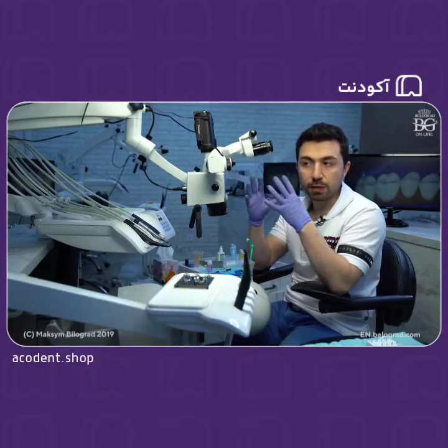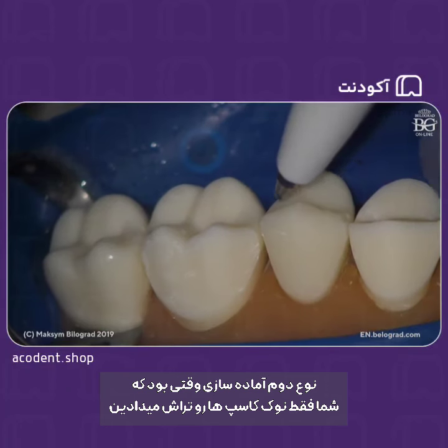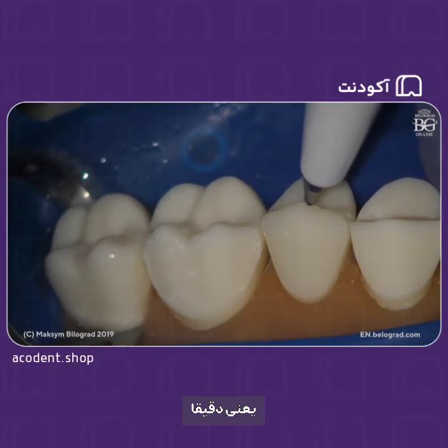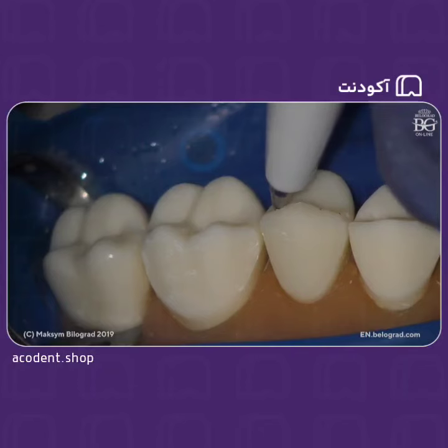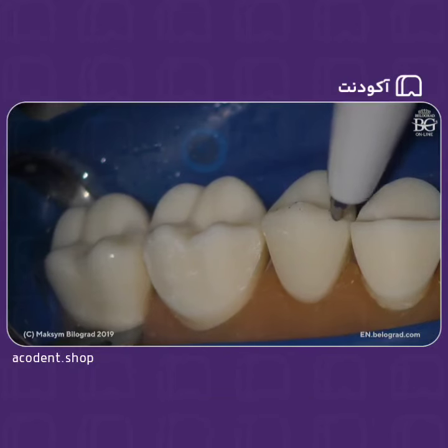Okay. The second type of preparation is when we just cut the tips of the cusps, and you can see now the sharp ridge here, exactly where the occlusal surface begins. This is the butt joint area all the way. It's a platform.